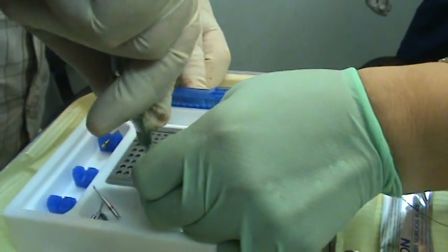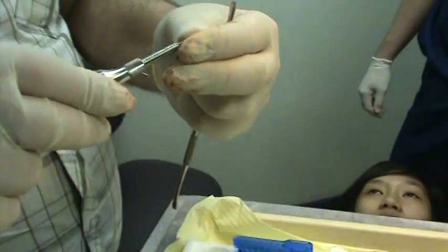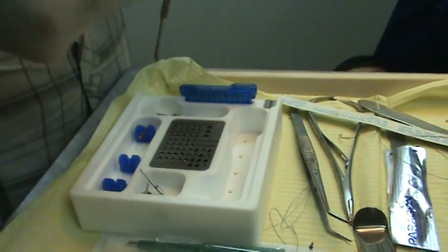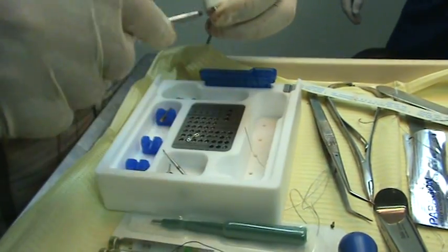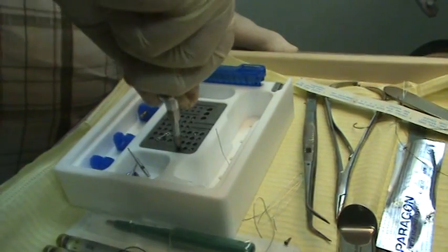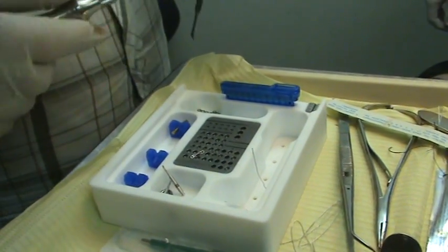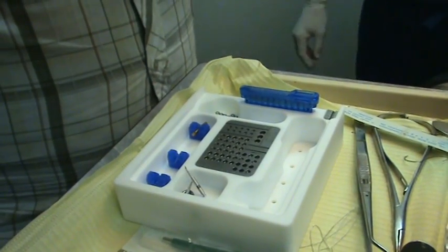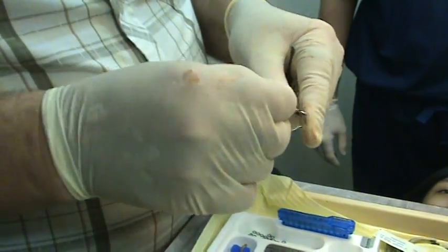And now I've got a wire stuck in here. I'm going to put the wire on everything. And then you press down probably about as much as you've ever pressed before, and then it locks in. You can almost feel it and hear a snap — if you're lucky, you can feel it and hear a snap. And that's the whole purpose of this; otherwise, we don't need it.